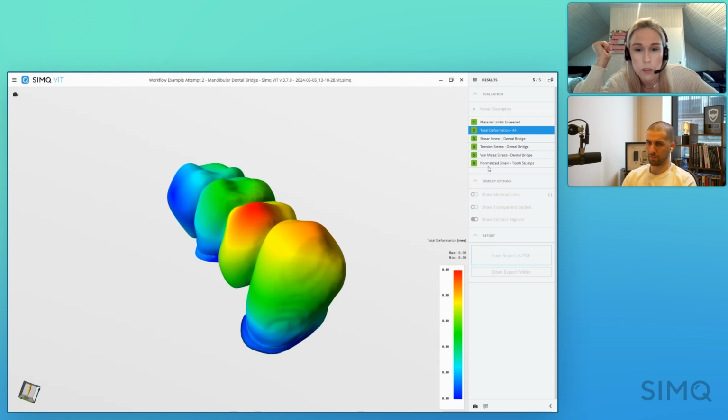Let's check the questions. I think it's a more specific, more technical one from Ismail. Thanks for the presentation. Are you considering bone remodeling and osseointegration in your numerical models? This is probably one for the engineers. So, well, actually, yes. So the actual integration into the software, but I know from the medical perspective, the osseointegration. So again, we had already touched on this before we started recording.